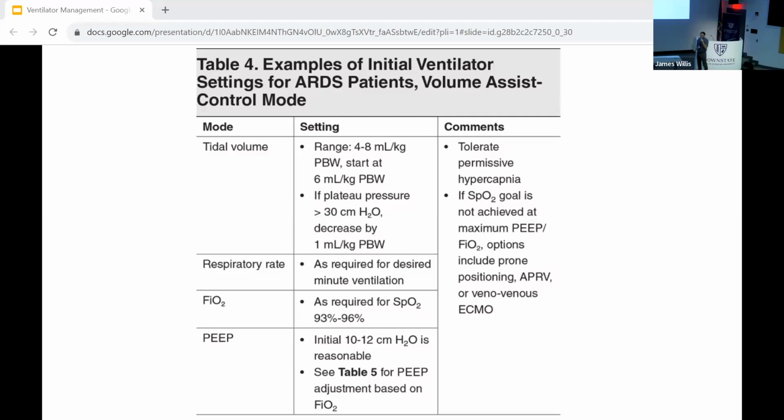Make sure when you get the blood gas, if the PCO2 is 60 and the pH is 7.25, that may be perfect for that patient, that we don't start adjusting things and then running into causing harm.